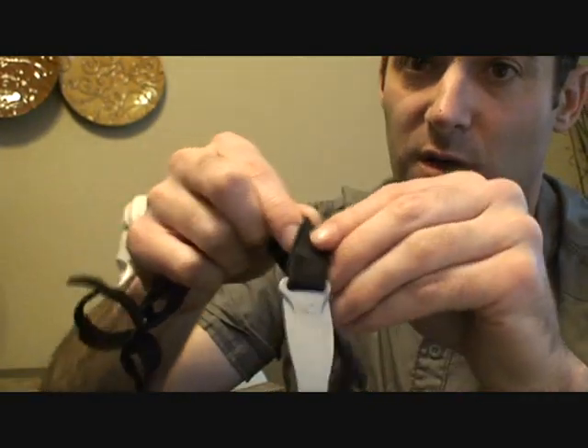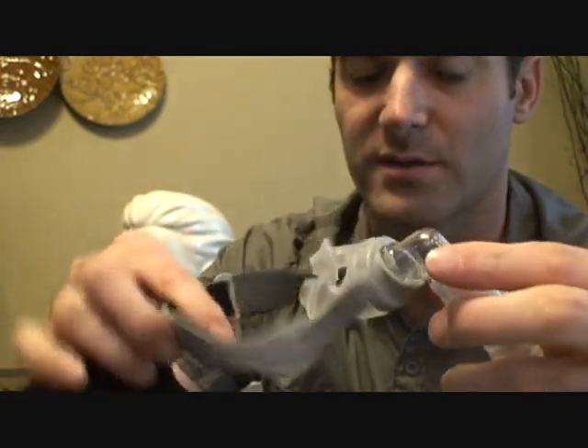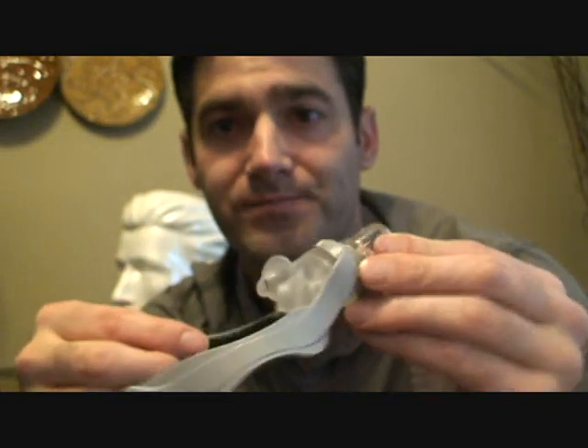You can also take off the strap to remove the headgear, and then just clean the colored parts that are gray. The nasal piece, if you ever want to change it, is just held in by pressure.